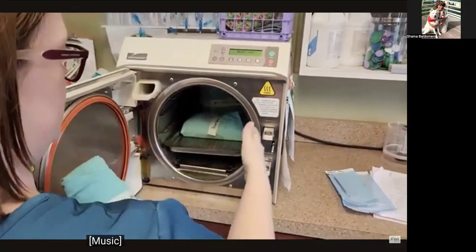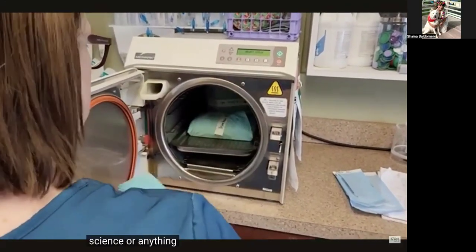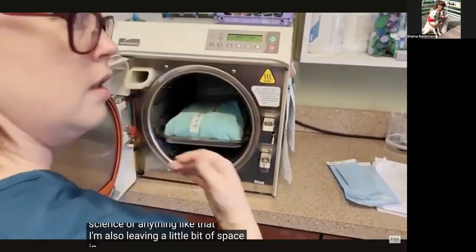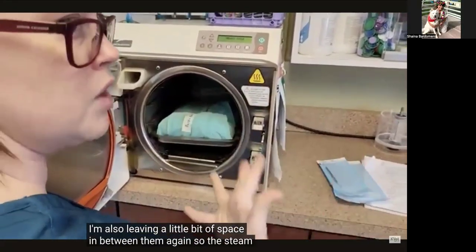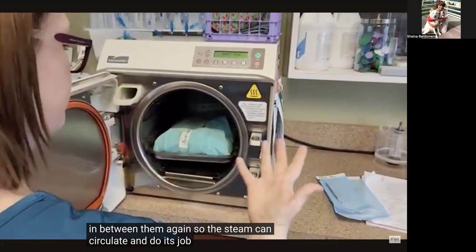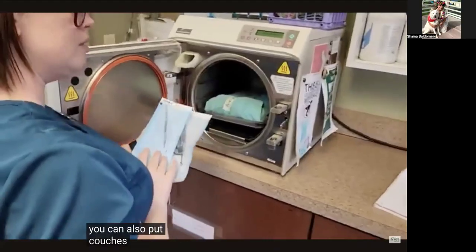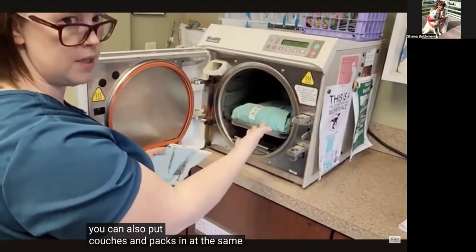Again, you want to make sure that it's not touching sides or anything like that. I'm also leaving a little bit of space in between them, again, so the steam can circulate and do its job. You can also put pouches and packs in at the same time.